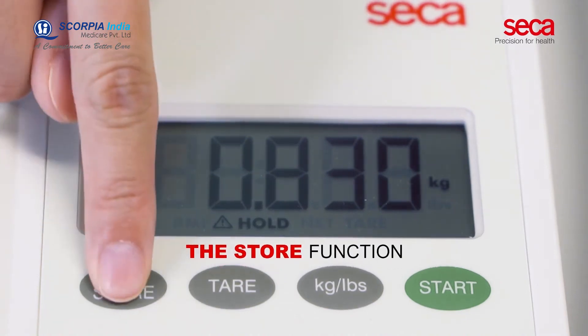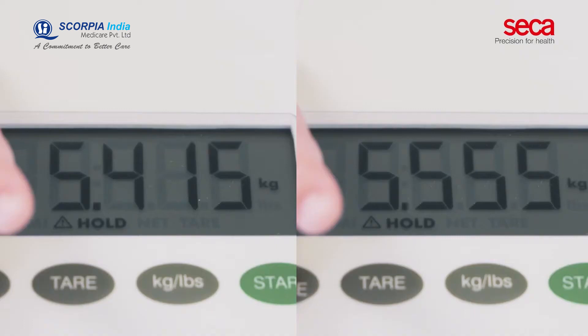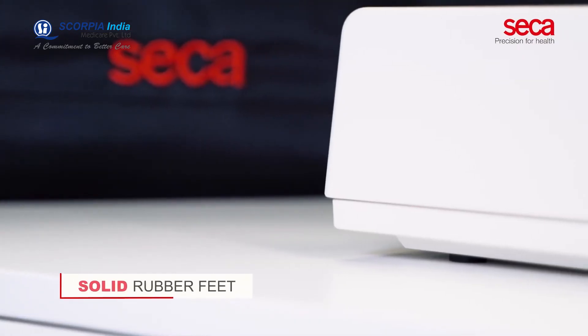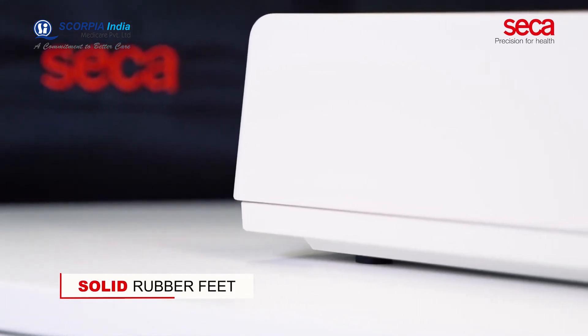The store function calculates the amount of breast milk intake — the subject is weighed before and after breastfeeding. The solid rubber feet of Sika 334 ensure a firm stand on any surface.